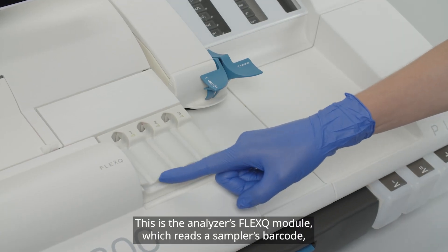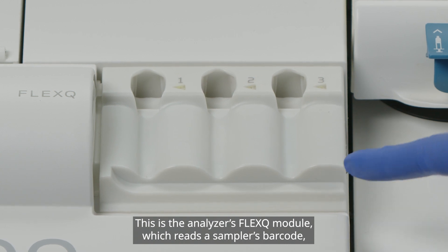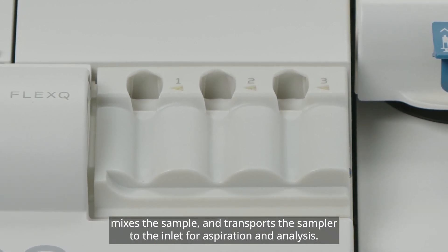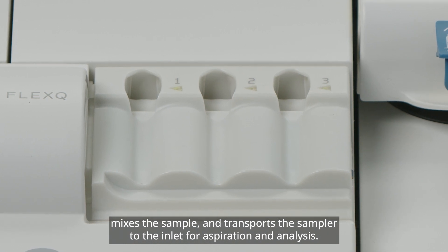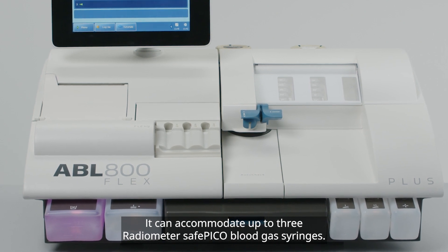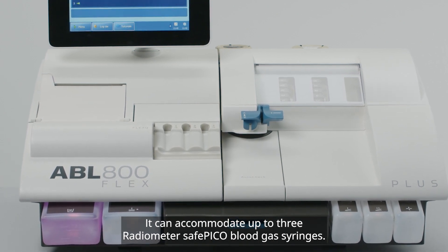This is the analyzer's FLEX-Q module, which reads a sampler's barcode, mixes the sample, and transports the sampler to the inlet for aspiration and analysis. It can accommodate up to three Radiometer Safe PICO blood gas syringes.